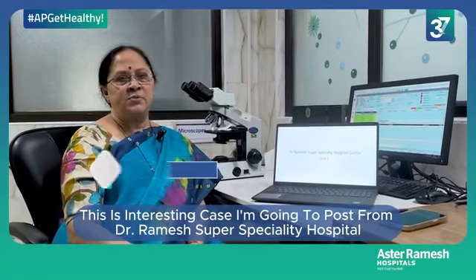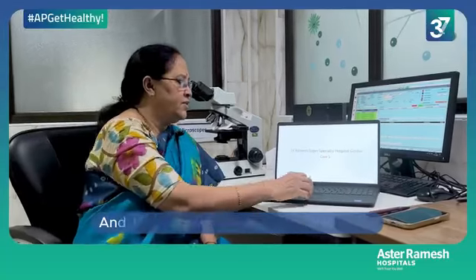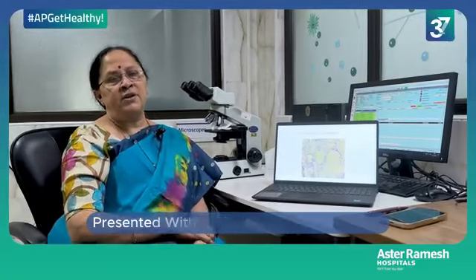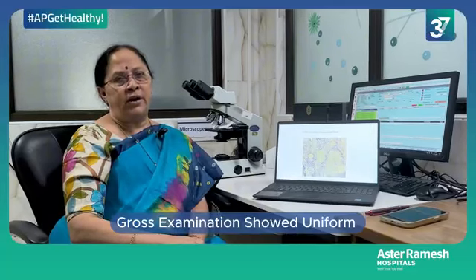Ramesh Super Specialty Hospitals. This is interesting and useful to the residents of pathology, and this case is reported in our hospital. So, this is a 45-year-old male patient presented with cervical lymphadenopathy. Gross examination showed uniform gray white appearance.